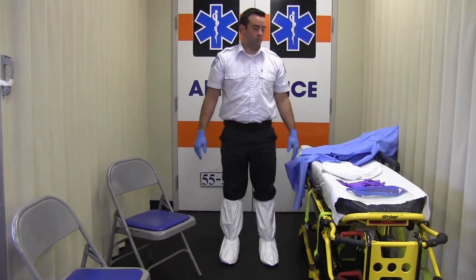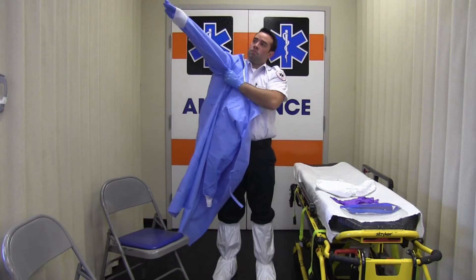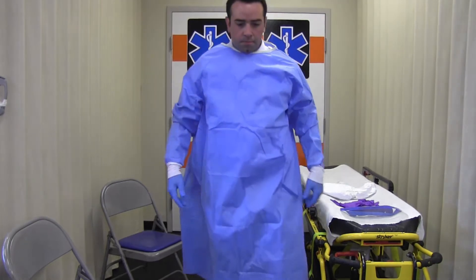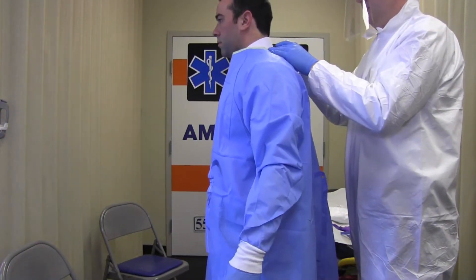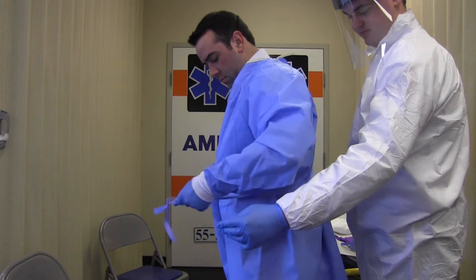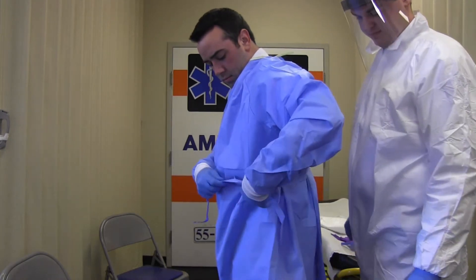Once your boot covers are on, you will then put on your gown. Ensure that the gown is large enough to allow unrestricted freedom of movement. Once you have your gown on, ensure that the cuffs of the inner gloves are tucked under the sleeve of the gown. If possible, the gown should be tied in front so that it can be untied without assistance during the doffing process.